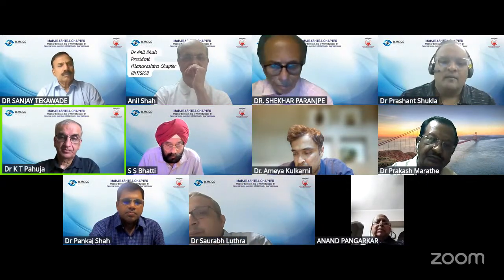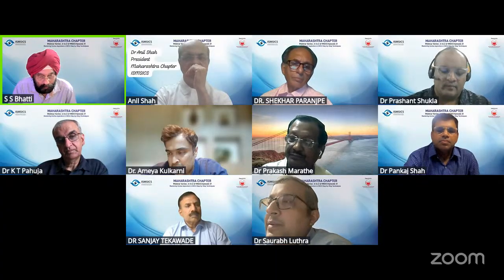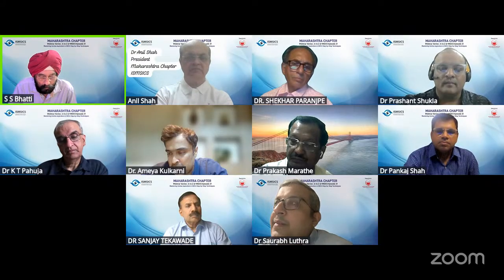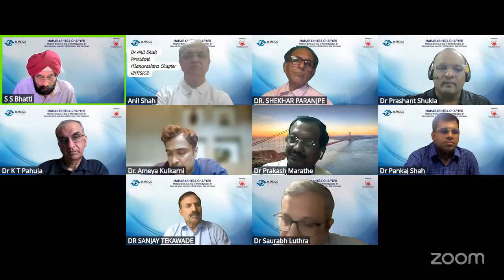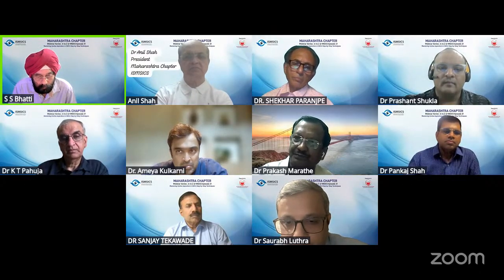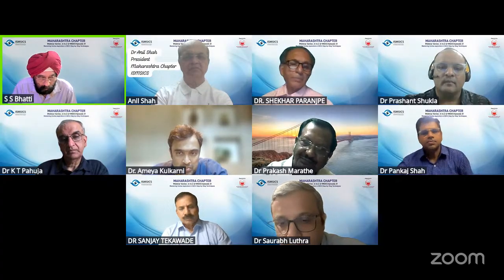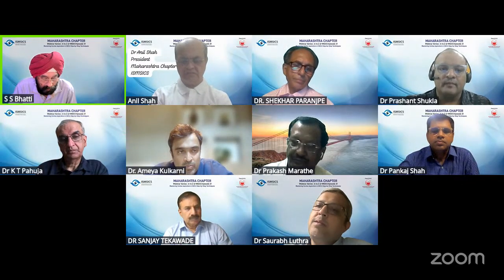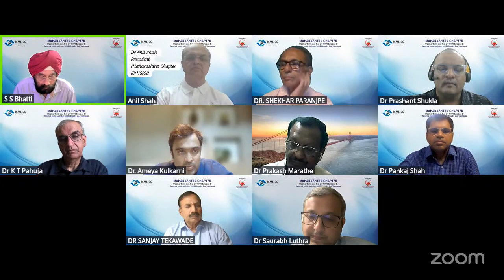So although everybody doesn't like to talk good about can opener, as far as PCO is concerned, can openers definitely give you way less PCO than with Rexes, possibly because you remove a lot of the anterior capsule that contains the cells that will contribute to the fiber growth. But the fact that lots and lots of those patients are coming 20, 30 years later with no PCO whatsoever, it's quite amazing even to me.